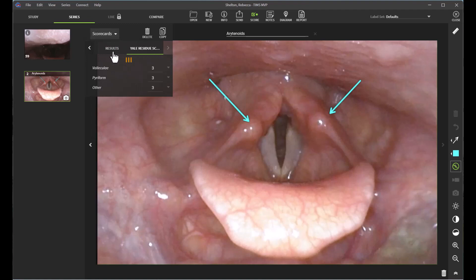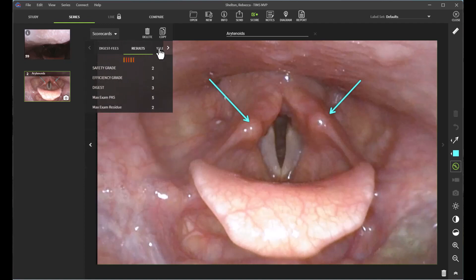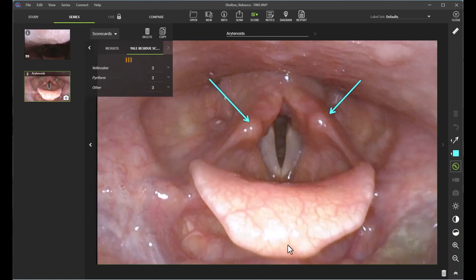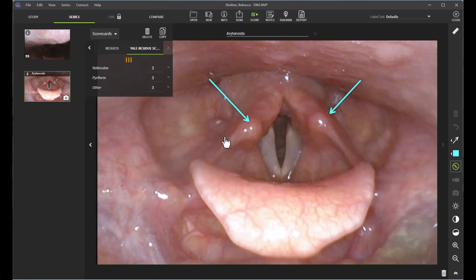I went ahead and did the Yale and the DigesT FEES scorecards. You can easily see that by clicking these headers and viewing the results. As I'm going through and analyzing my study, I can take notes by clicking the notes icon, which brings up a sticky note. You can see I already typed in some notes about this hypothetical case. When you exit out, it doesn't delete the note — it just removes it from view, so your work is saved.